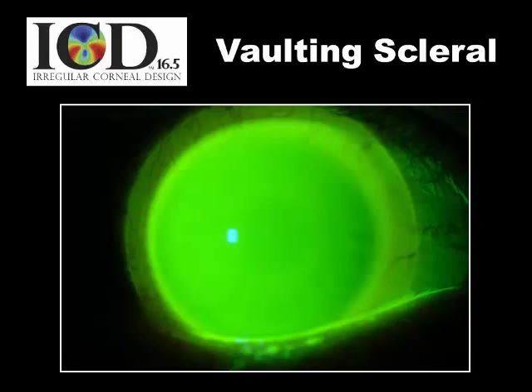So 100% of the weight and pressure of the lens should be out here on the conjunctiva, and we should completely vault what's in the center. So regardless of how asymmetrical, how tilted, how bulging the cornea is, the ICD should completely vault over top of that, like you see here, where it's difficult to make out the pupil, so you know you've got plenty of fluid between lens and cornea.